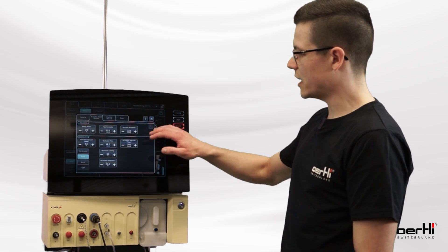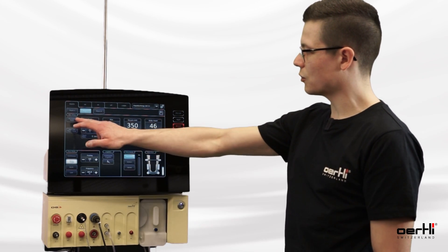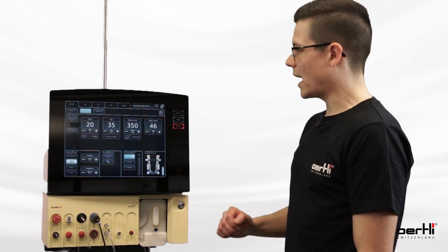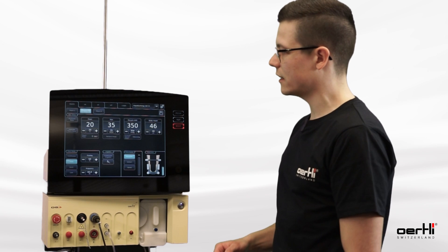Now I have saved all the values. I can close the AUX menu, and now this button — occlusion mode — appears on the display. I need to press this button to activate and to deactivate the occlusion mode.